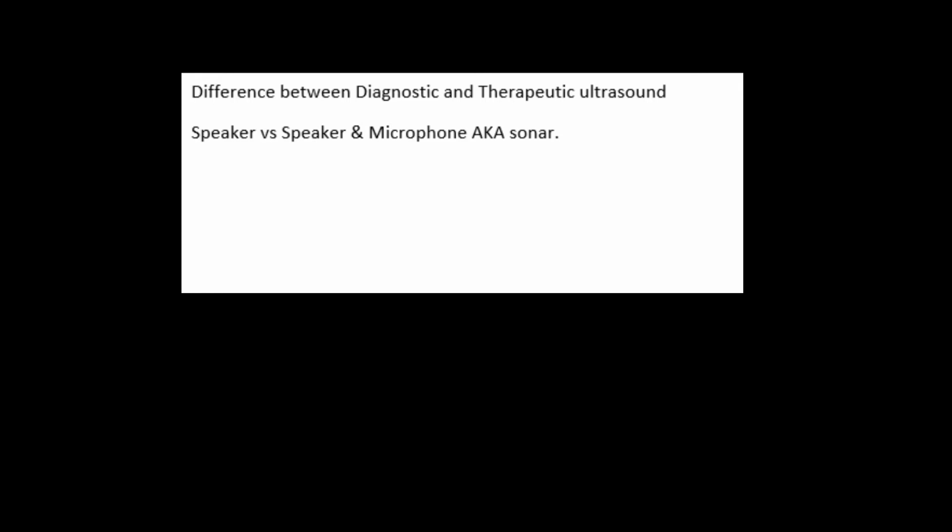That is probably also the major reason which accounts for the difference in cost between the diagnostic and therapeutic ultrasound models. You can pick up a therapeutic ultrasound cheap because a lot of places get rid of them fairly often because no one uses them. And then the diagnostic models are coming down in price. Don't get me wrong, they're much cheaper than they used to be, but they can still go from mild to wild in the thousands of dollars.